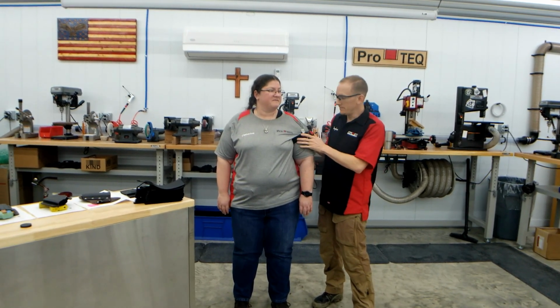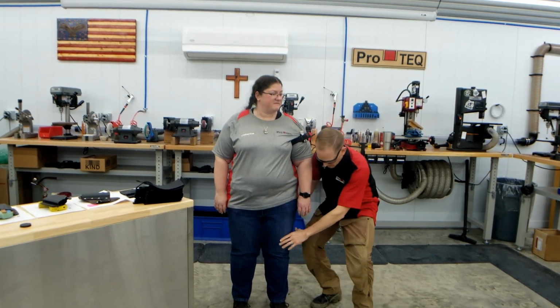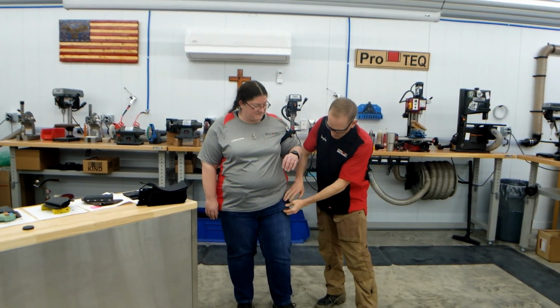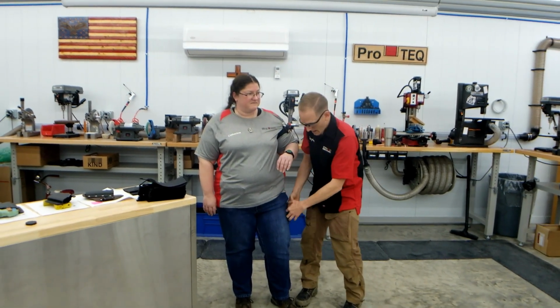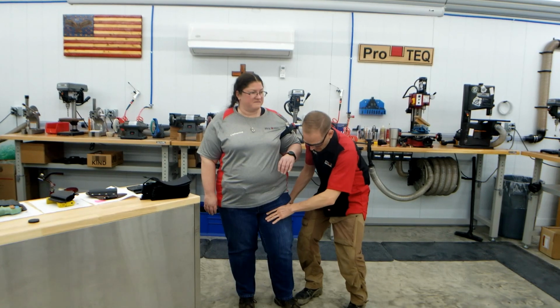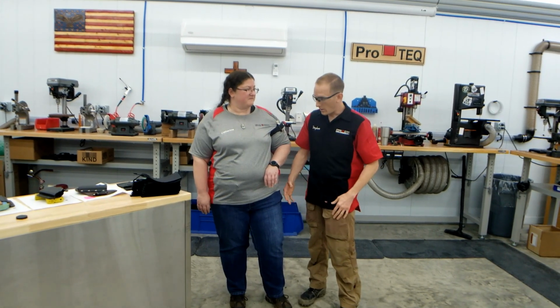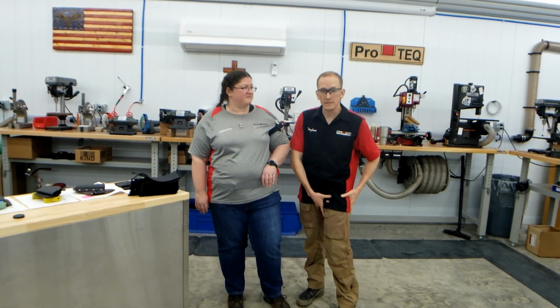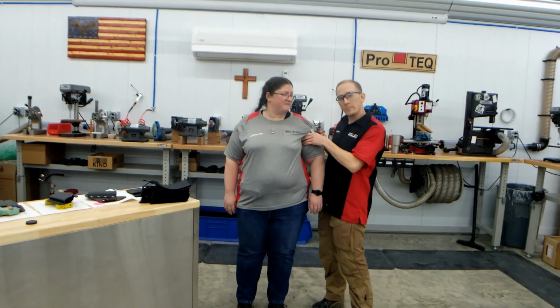But on a tourniquet, it's a really simple concept. You want to get it as high on the appendage as you can. So if it's a leg, you would want to get pocket stuff and holsters and whatever out of the way so that you can get just around the leg, around the fabric of the pants, so you're not pinching a knife or a wallet or a gun against the leg and potentially not getting that full compression all the way around it, because that's what it's all about. So you notice I went up into her armpit.